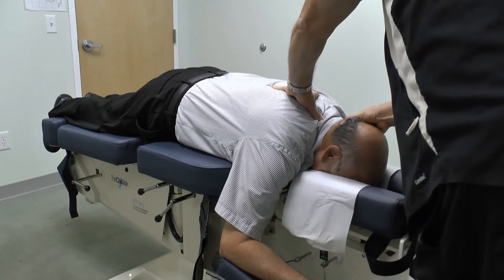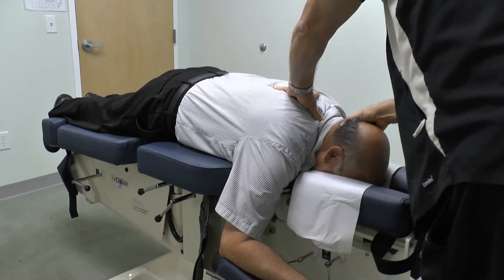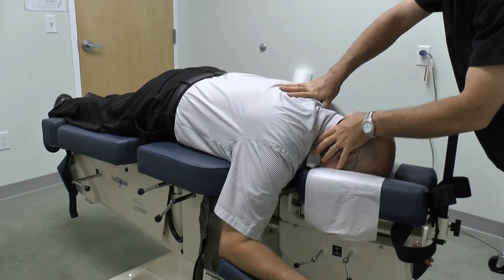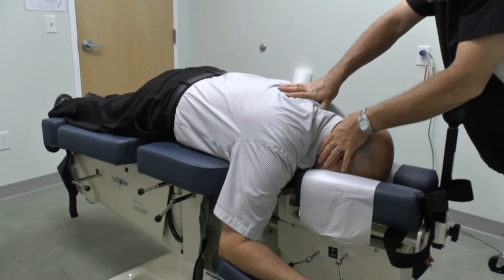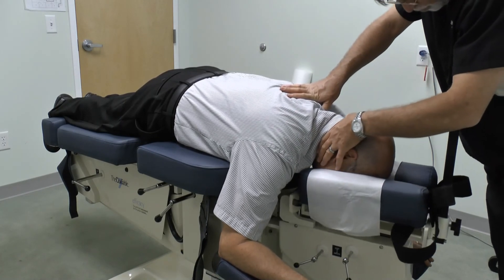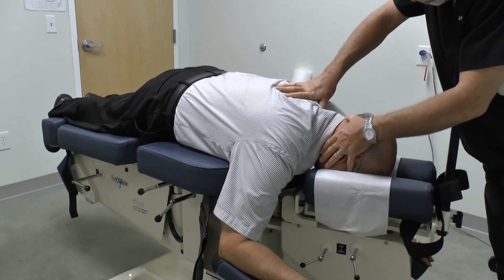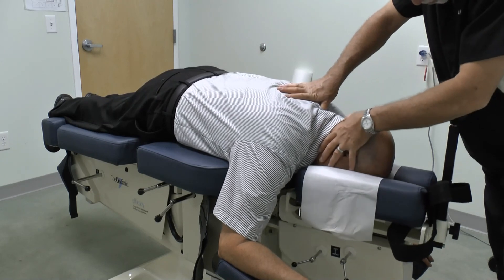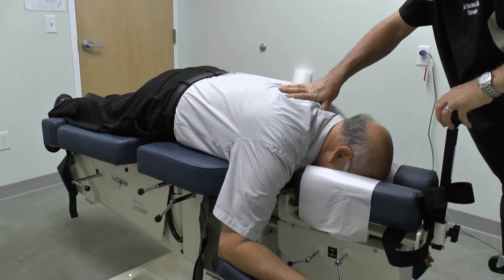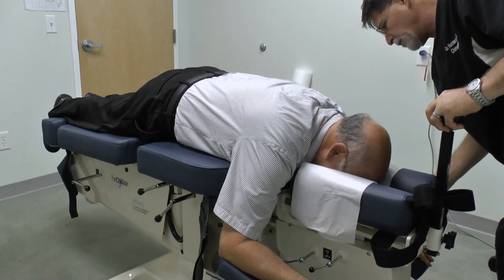Relaxing. Just make sure everything's locked.